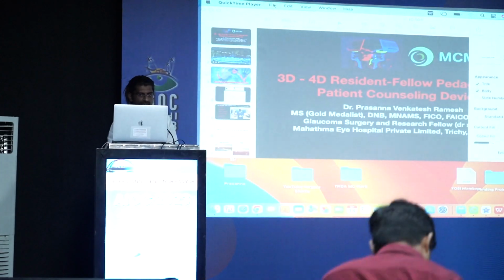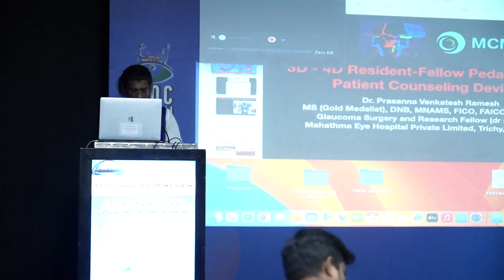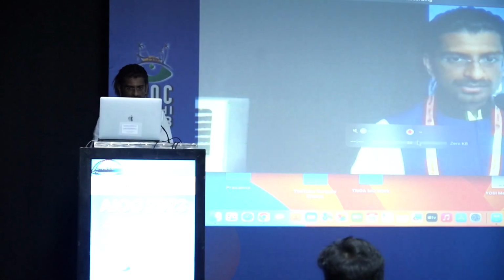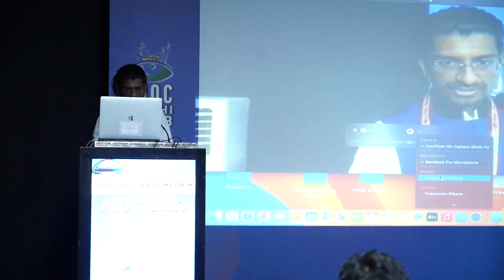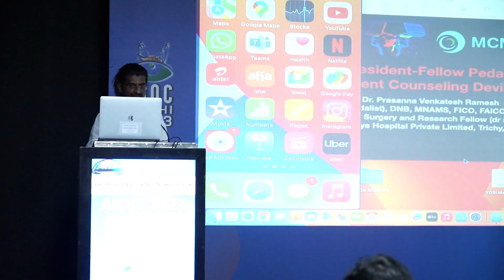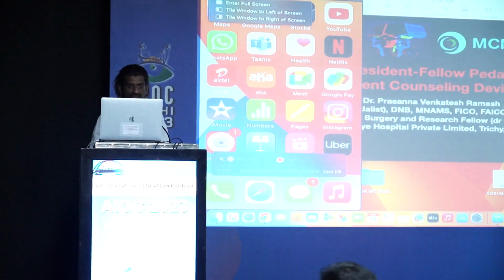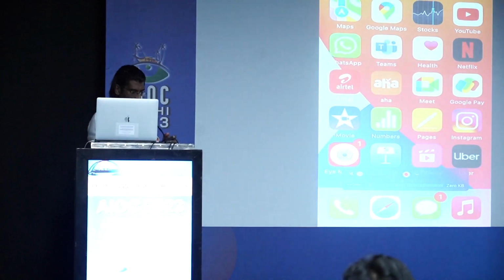I would like to start off with a demo in my smartphone. I'll try to stick to the time and finish it off quickly. Can you see the slides here? This is now my smartphone, so this is a benefit of the videographer. Is the video on? Video is on, superb. So this is my phone that you can see.